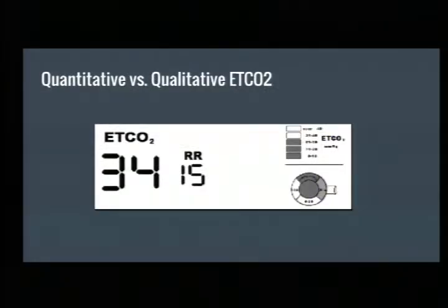Again, for some of you, I don't know if any of you in here are old enough to remember the little color changes that you put on when you intubated and they turned pink or purple or stayed yellow. So that was a qualitative yes or no: do you have end tidal change?